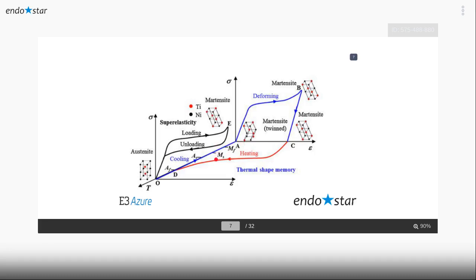It's still stable, but can still go through curvatures, deep canals, and calcification. Whenever there is loading, it can take all this load and at the same time deform without fracture, taking more cyclic fatigue and more torsional fatigue without separation. I hope you understand this curve. We will go to the next slide.